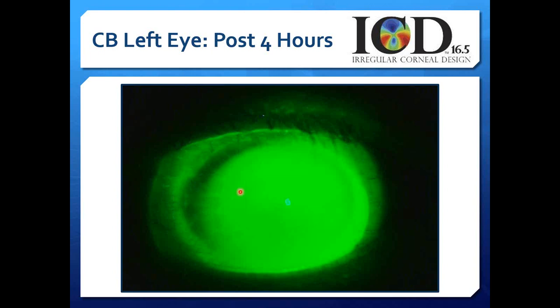If the lens continues to have that temporal inferior decentration, then even after you increase the limbal clearance zone, you may still see some of that arcuate thinning. So if you're worried about it, then have the patient wear the lens for a good portion of the day, come back, pull the lens off, stain the cornea. If you're seeing a clear cornea, you know you don't need to worry about it. This isn't actually touch, it's just a thinner amount of fluid than what we see here or what we see here.